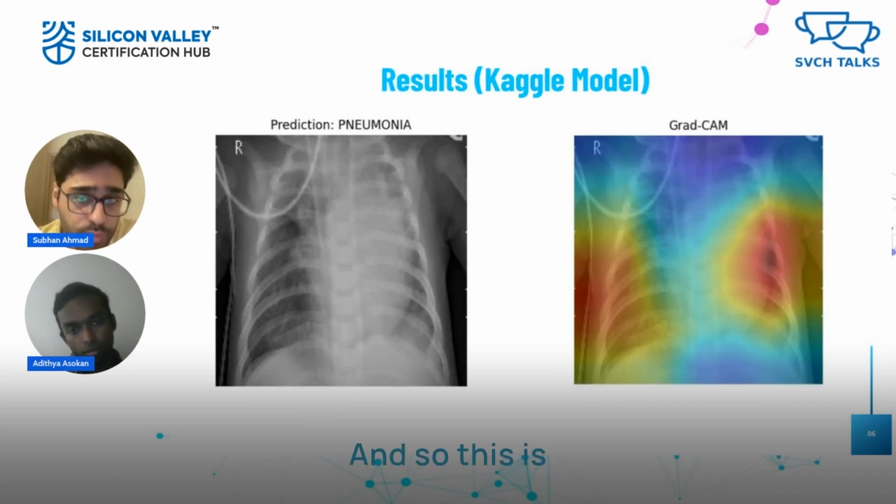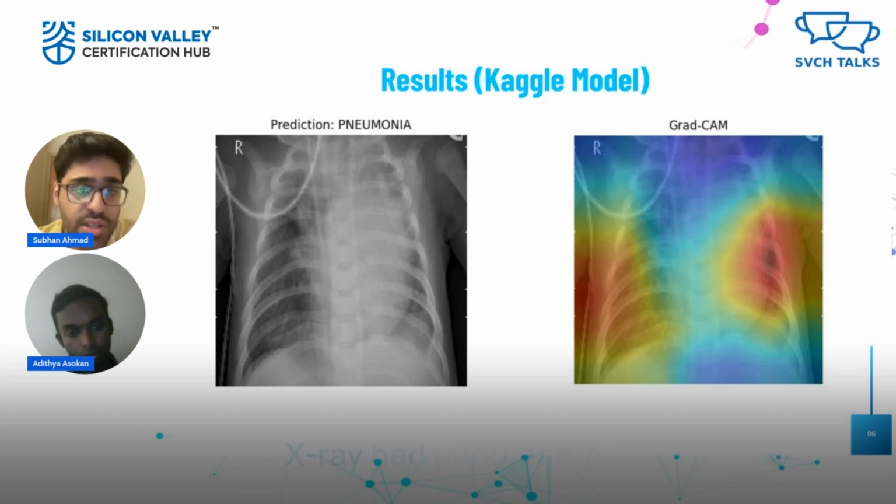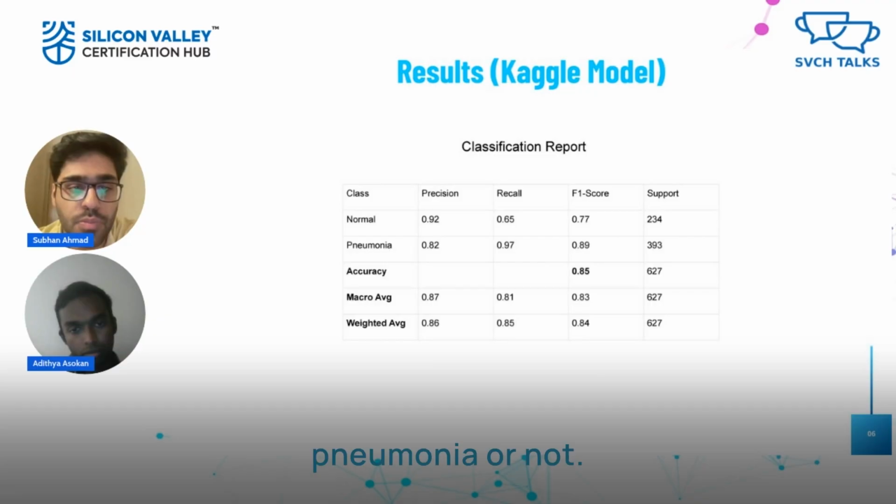And so this is a normal chest X-ray, and this person has pneumonia, and our model was able to correctly predict that this chest X-ray had pneumonia. The Grad-CAM on this image shows which areas in particular were really relevant in identifying whether this image had pneumonia or not. And this is our classification report for the China dataset, and it showed that the whole thing achieved an accuracy of 85% and did pretty well compared to an average radiologist.